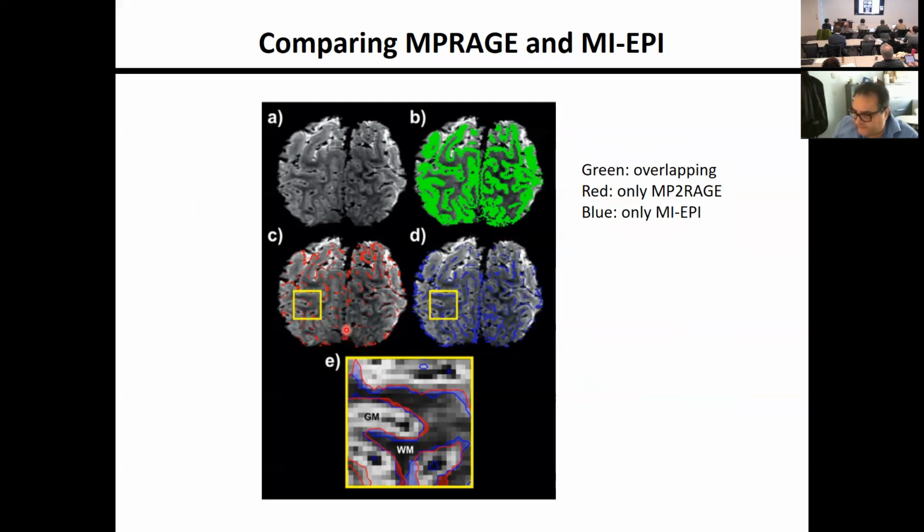Here is CSF. So as I said, it's very difficult. You can go through all voxels, all slices, and get some indication, but I would not trust my visual inspection, to be honest. It's good to look, especially if you have an ROI where you have the functional activation, to evaluate carefully, also with visual inspection.